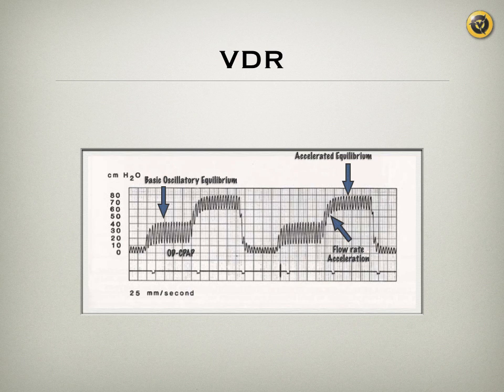If you come close to half of that on conventional mechanical ventilation, the patient will definitely get a pneumothorax. But in this mode, the patient tolerates that very well because it's oscillatory, and hence the pressure does not transmit directly to the alveoli all the way, causing barotrauma.